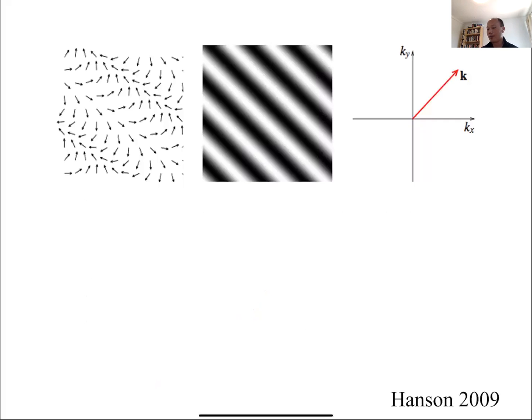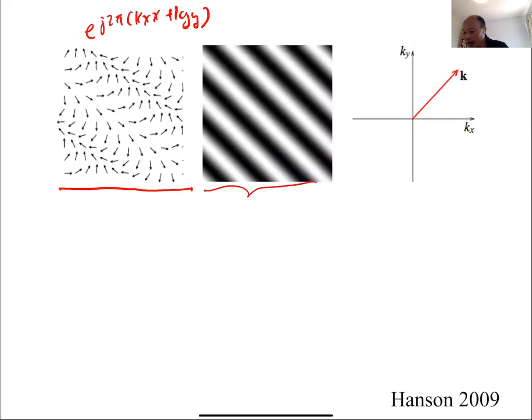Okay, so just to give an overview of what k-space looks like, we've mostly focused on these spatial patterns. But for MRI, we really want to start thinking about things in terms of the phases. For every one of these image patterns, there's actually a corresponding orientation of the spins. In fact, this is essentially a physical implementation of this complex phasor in 2D. So here you notice that it has these diagonal patterns in terms of the phase orientation.